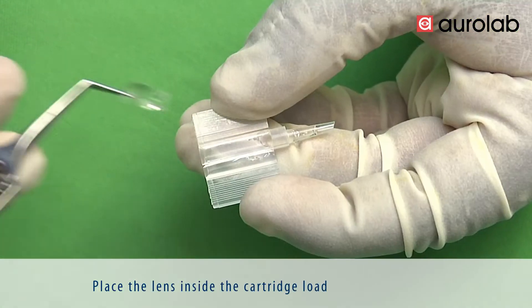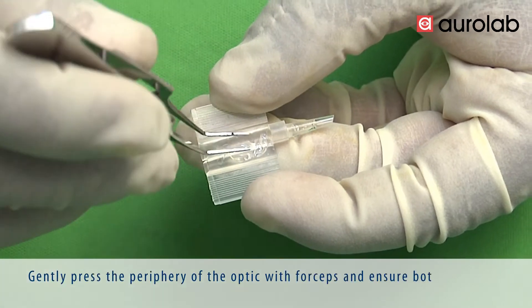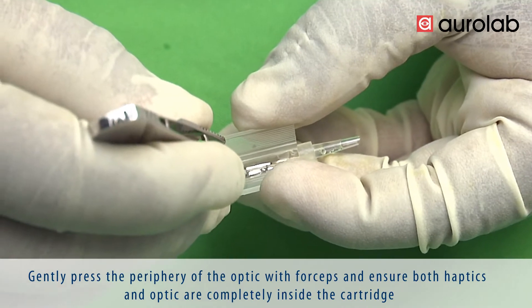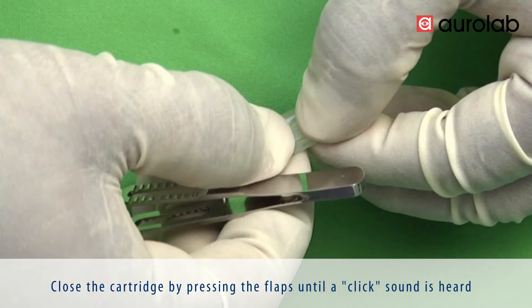Place the lens inside the cartridge loading chamber. Gently press the periphery of the optic with forceps and ensure both haptics and optic are completely inside the cartridge. Close the cartridge by pressing the flaps until a click sound is heard.